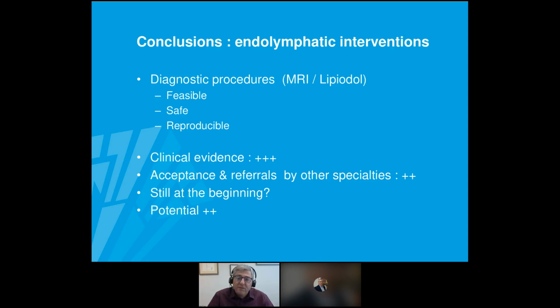But in contrast with iodized contrast medium, we've now already done more than 100 of these procedures and we've never seen any pain complications due to the extravasation of Lipiodol. With iodized contrast medium, once you have extravasation, that's quite painful. But with Lipiodol, we've never seen this complication.